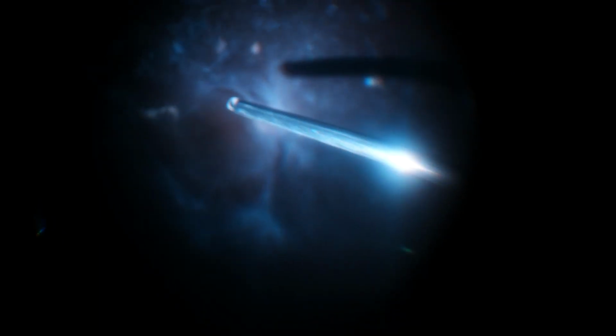In the third case scenario, once again a pars plana vitrectomy was started. With completion of a core vitrectomy, the posterior hyaloid was stained with intravitreal triamcinolone acetonide. The next step was membrane dissection using a vitrector, with a high magnification view assisted by the intravitreal forceps.